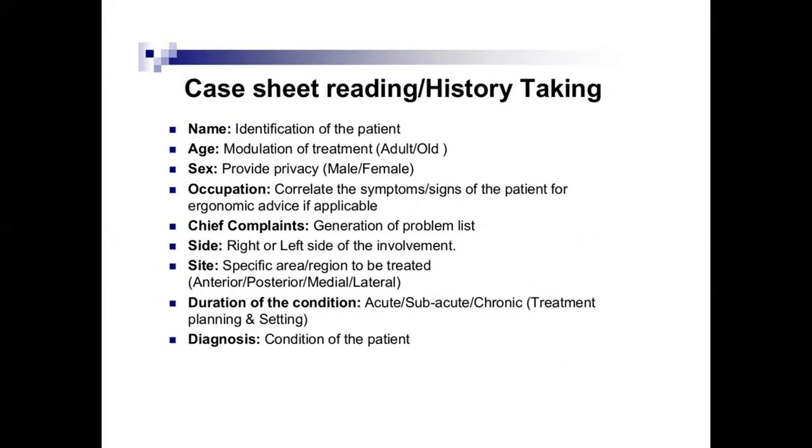Chief complaint, generation of a problem list, side, right or left side of the involvement, specific area, region to be treated, anterior, posterior, medial, and lateral. Duration of the condition, acute, subacute, chronic, treatment planning and setting. Diagnosis with the condition of the patient.